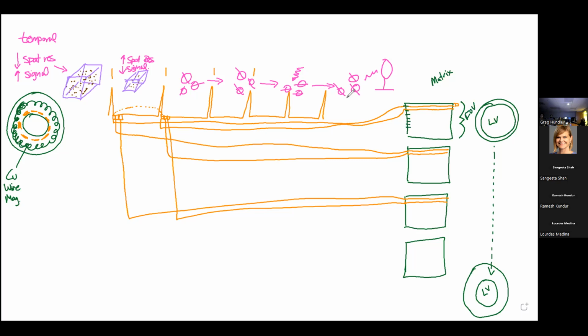But what did we suggest were some common fields of view? Like, if we're going to estimate this distance from front to back, we were talking about fields of view of 40 centimeters, or maybe 36, something like that. And then we talked about a matrix, how many lines we were going to put in here to fill up that field of view. And we were talking about something like 128 by 128, or if we wanted a little higher spatial resolution, 256 by 256. What I mean by 256, you got 256 this way, and then you got 256 this way, right? So that's wonderful. Let's pick the lower resolution.